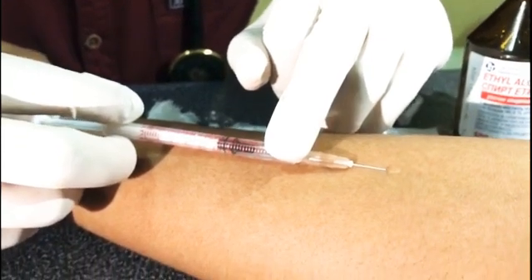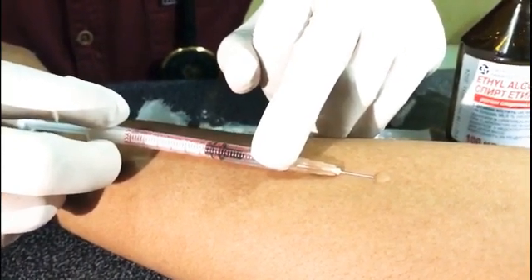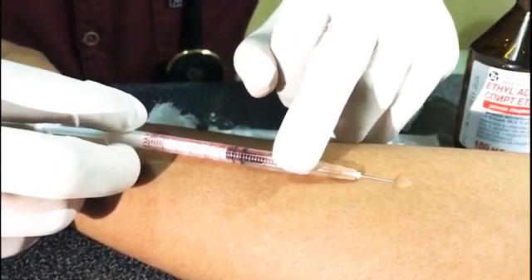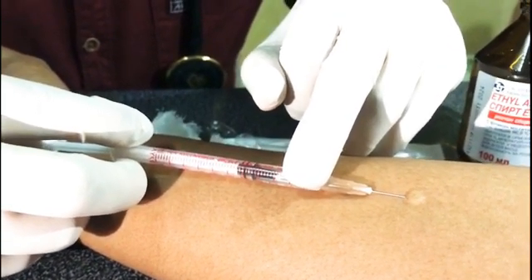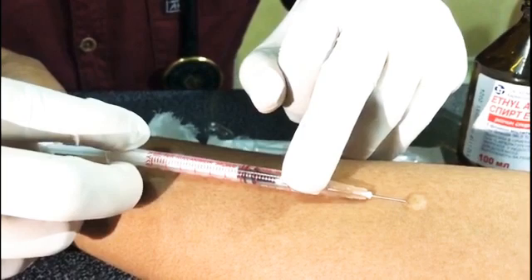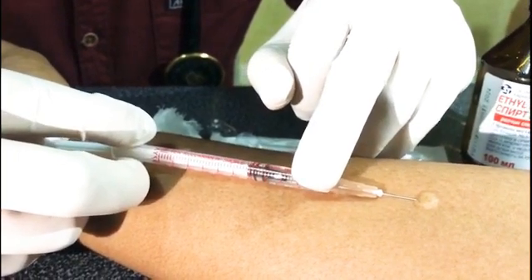Now you will observe that a papule of approximately 7 mm maximum has appeared. If you see this papule, you are done — the intradermal injection is perfect.